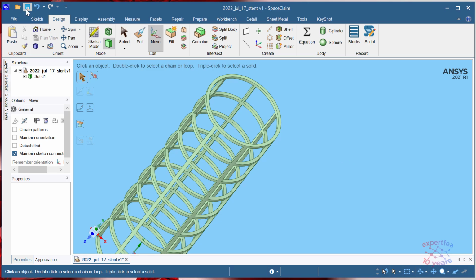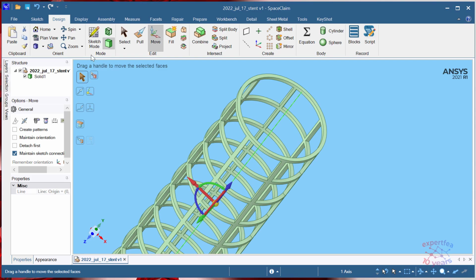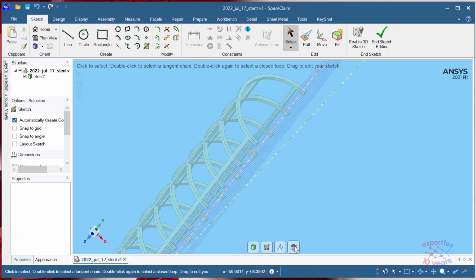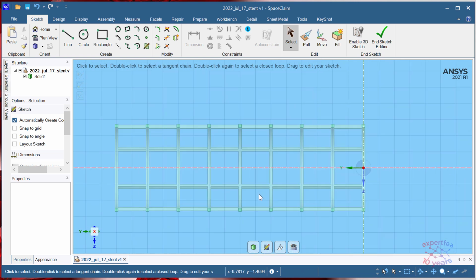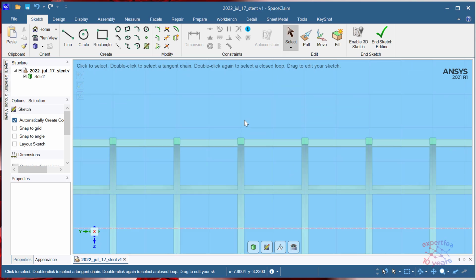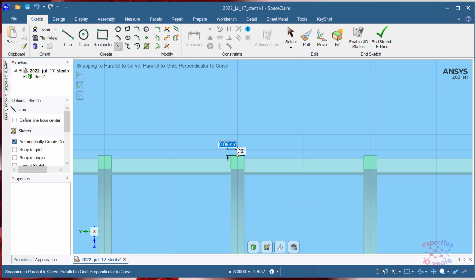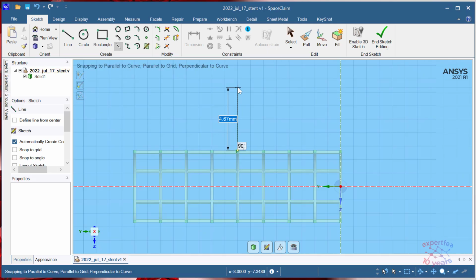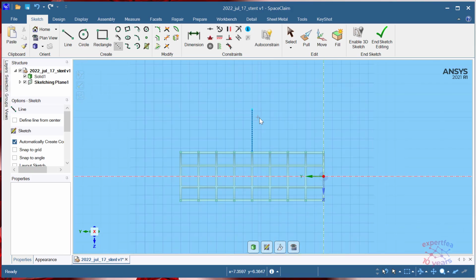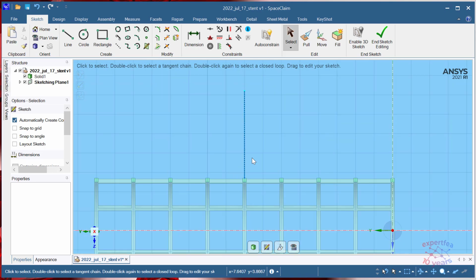Yes. Let's save, and we're going to create now the blood vessel with the plaque. I select this edge, I'm going to the sketch mode, and here we have the plane view. Because we have 1, 2, 3, 4, 1, 2, 3, 4 windows, this means here we will have something like a symmetry. So I would like to isolate to show the axis, because I would like to create a plaque which is symmetrical to this axis, let's say, yes.